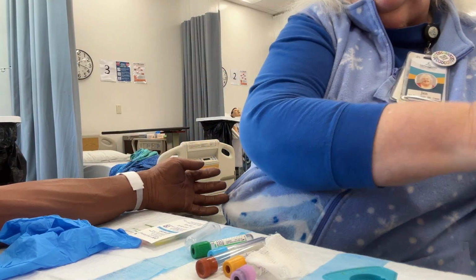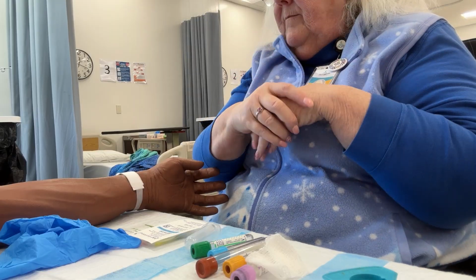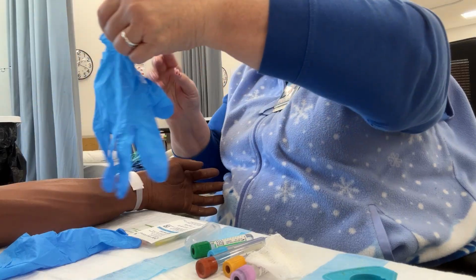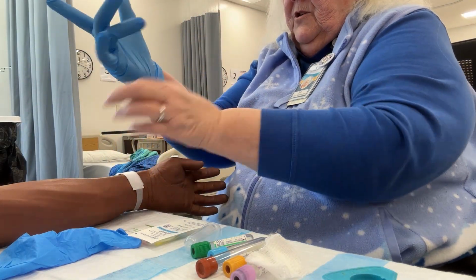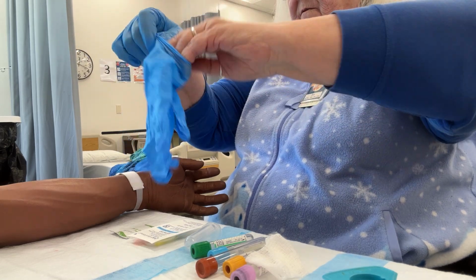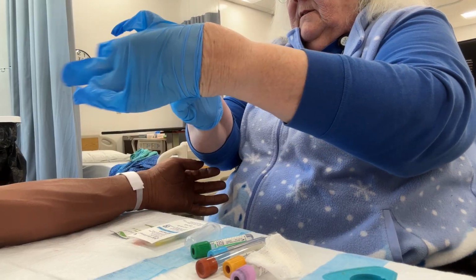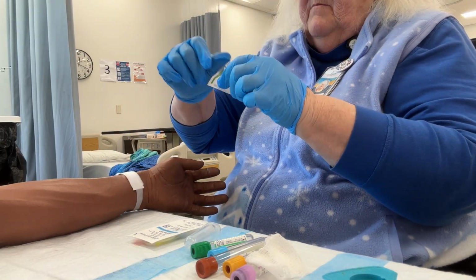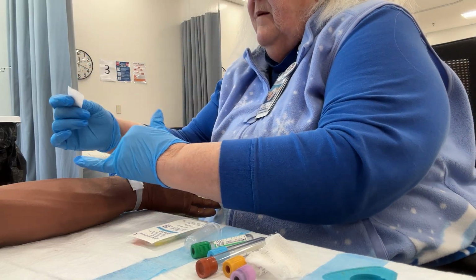I've touched my patient, so I need to wash my hands again, and this time I can use the sanitizer. I'm going to put on my gloves. And remember, you don't want your gloves touching anything, so you're keeping your hands up and in front of you and not where you're going to drag the fingers on some equipment. I'm going to open my alcohol pad and clean my site. I immediately put stuff in the trash can right beside me.